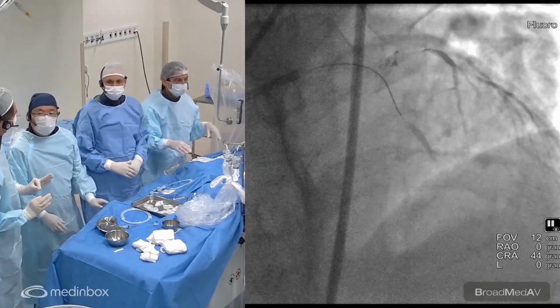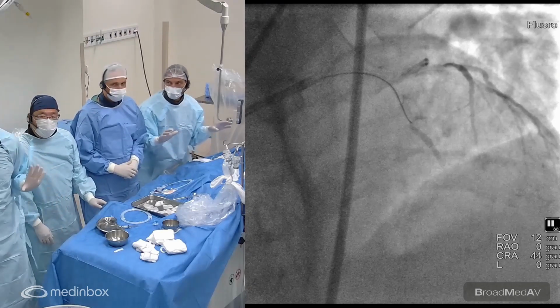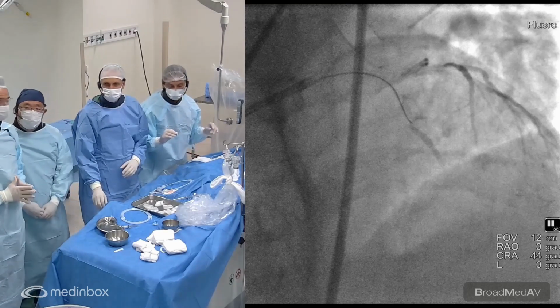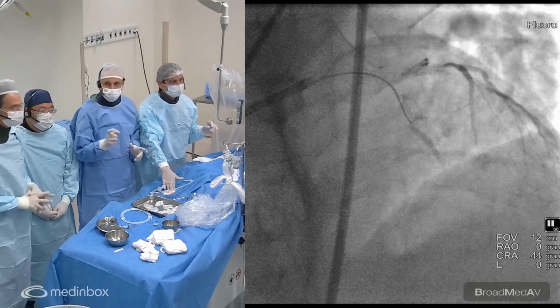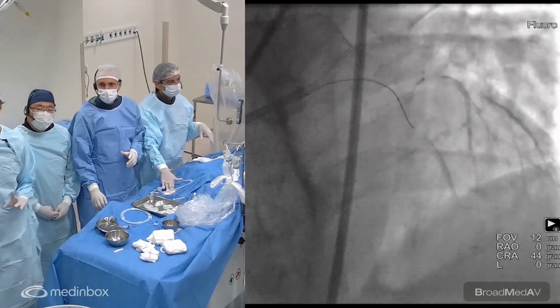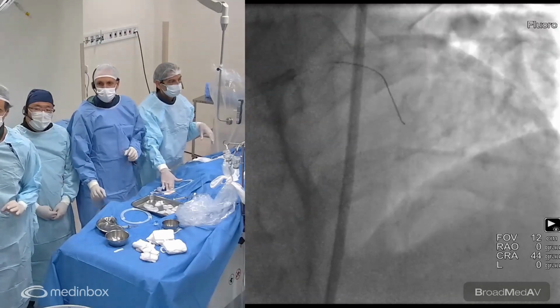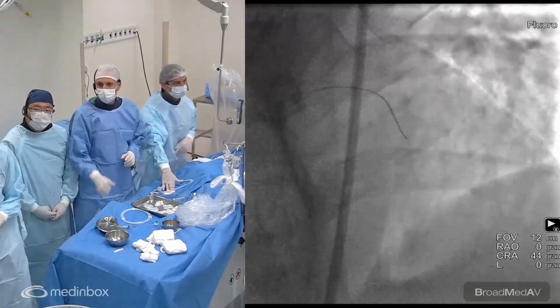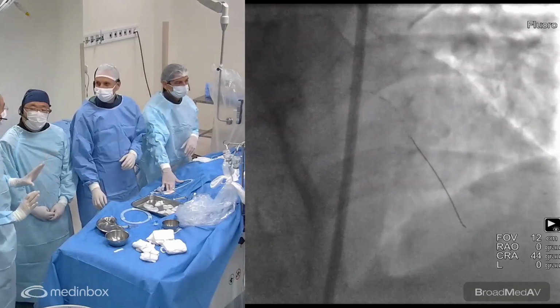Do you usually bring the balloon close to the wire at this point? In this case, no, we don't need it. No balloon. Only the wire. Simple one. Yes. Great. And this is the position where you feel comfortable, you can advance, and you have the bend, you can direct to the right place. Okay, perfectly. So now you're going to advance the wire. Let's see. Turn down. So, yes. Turn to one side, the other, and then it just slips through the true lumen. Okay. That's a very nice technique.